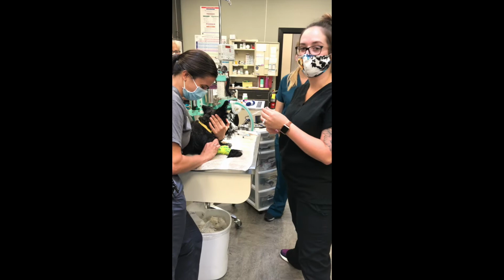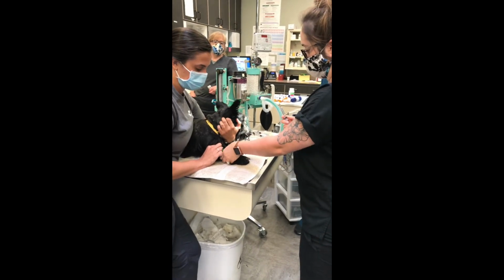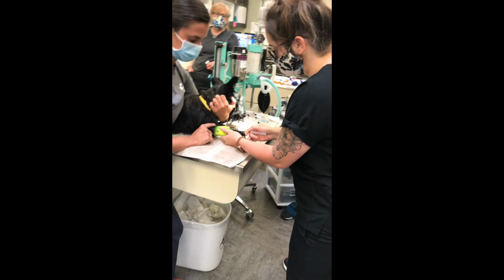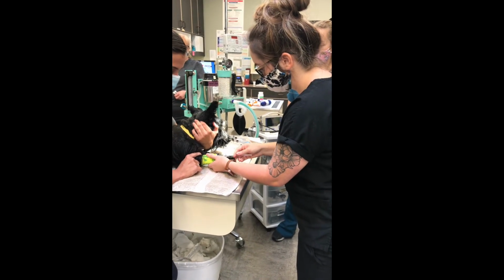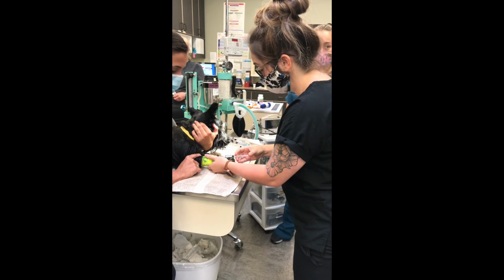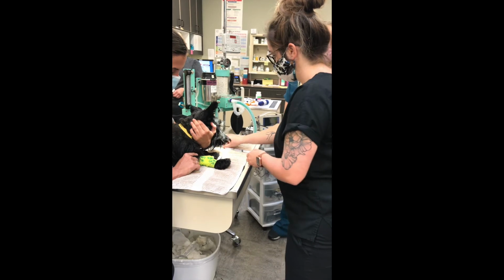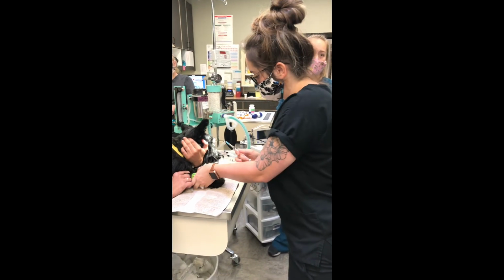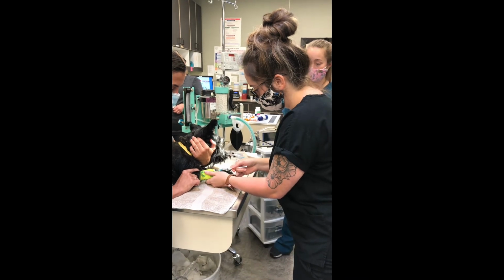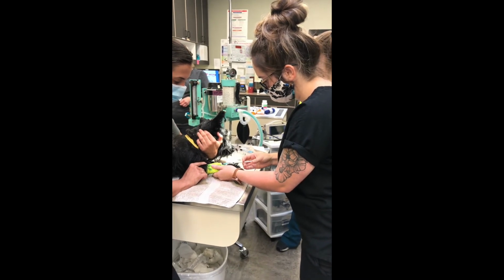That's it. We're going to go ahead and induce this patient for his neuter. I'm going to flush his catheter. And he's going to get Valium.